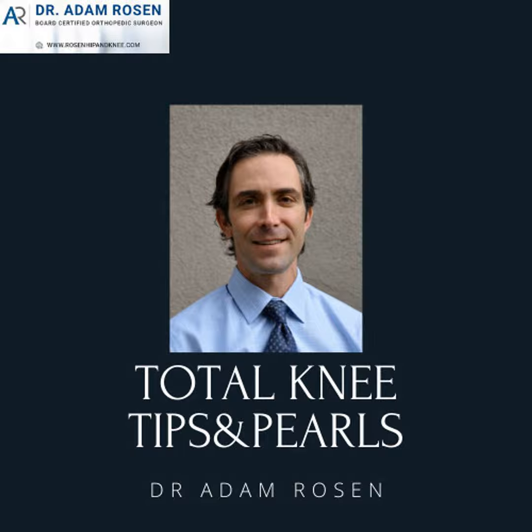And typically for my primary, this is where I'm just excising a little synovium above the femur to allow me for sizing later to see that aspect. But at this point, I do a pretty extensive synovectomy. So whether or not, obviously, if they have an infection, you're doing an extensive synovectomy anyway, but even for polyethylene wear, just a revision for loosening, this synovium does tend to get in the way.